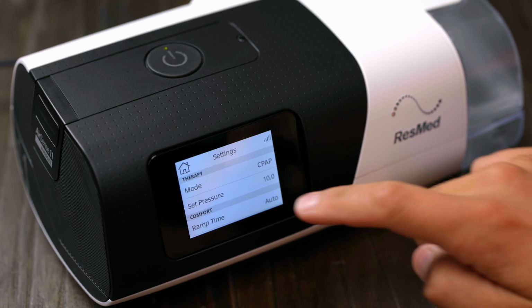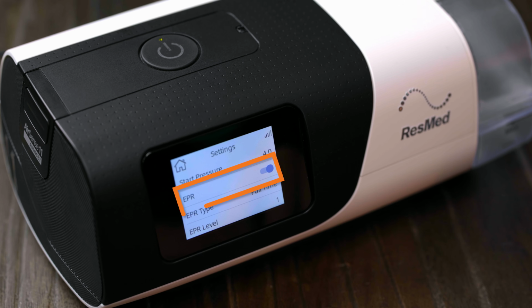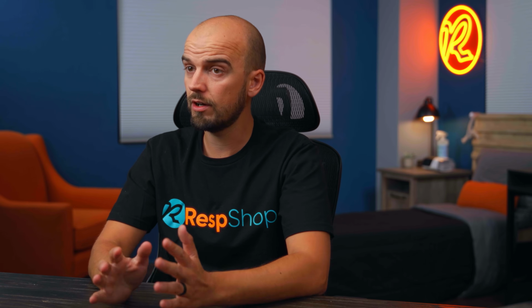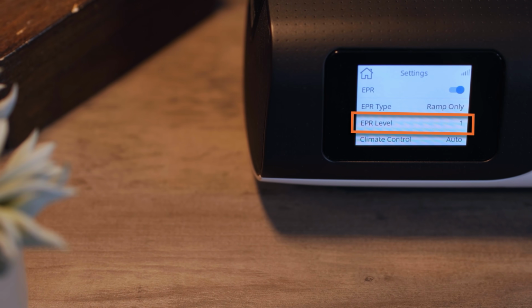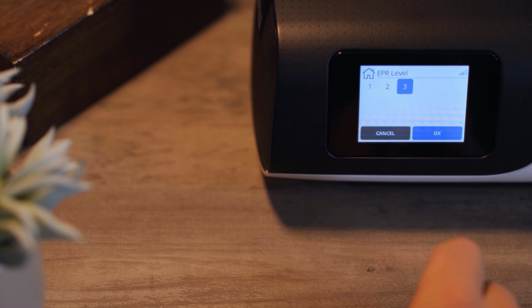Now, this feature goes by various names depending on your CPAP brand, like EPR or Easy Breathe. Whatever name it goes by on your machine, it will drop the pressure when the therapy algorithm detects that you're breathing out. The level of drop will depend on the setting that you put for this, so it can be tweaked to make sure that you're able to sufficiently empty your lungs and then have the capacity to breathe air back into them without swallowing it. So increase the relief setting if you find exhaling difficult.